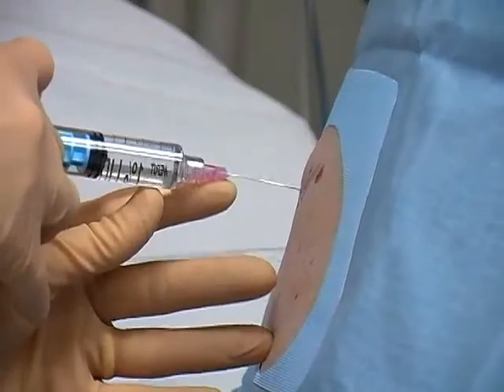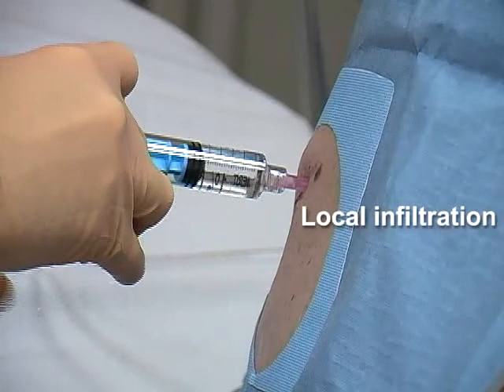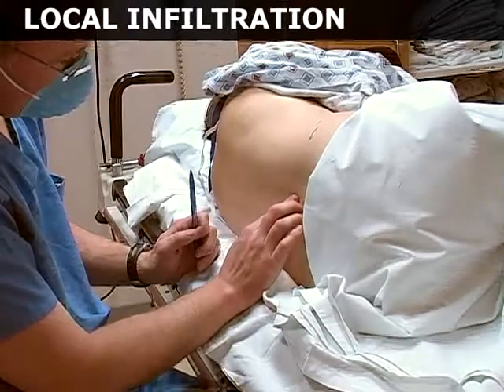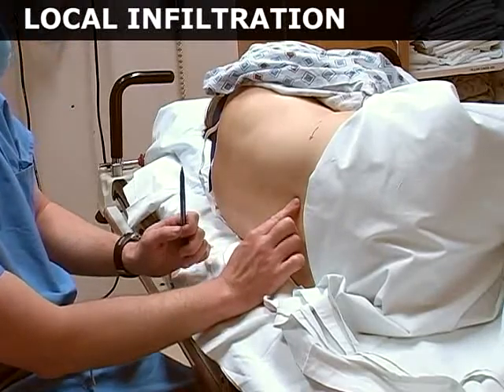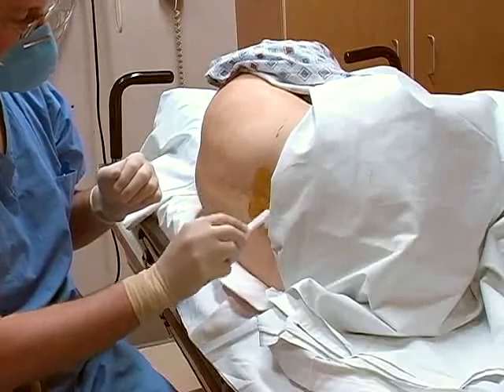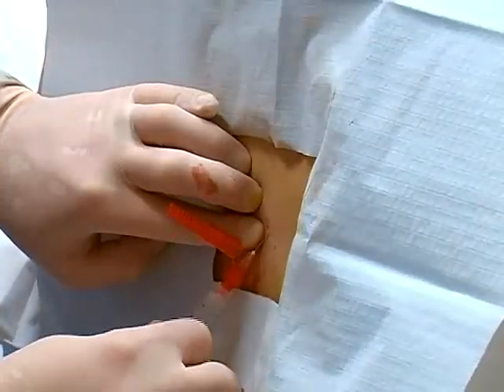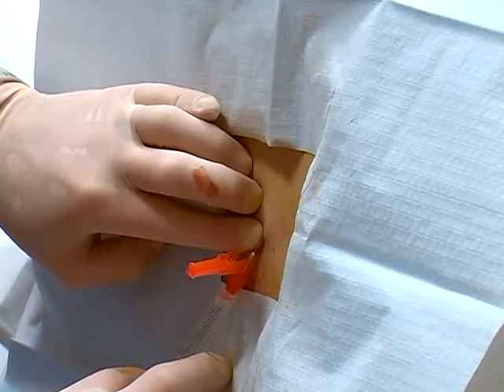In this section, we will demonstrate basic anesthetic techniques, including local infiltration, anesthesia for laceration repair, and field blocks. Local infiltration is used prior to procedures such as lumbar puncture, which is depicted here. Begin by cleansing the skin with chlorhexidine or povidone iodine. Insert a small 25 to 30 gauge needle just under the epidermis and inject 0.5 to 1 milliliter of anesthetic.